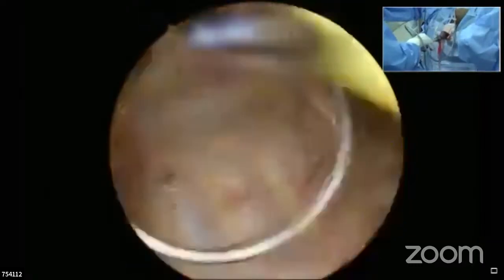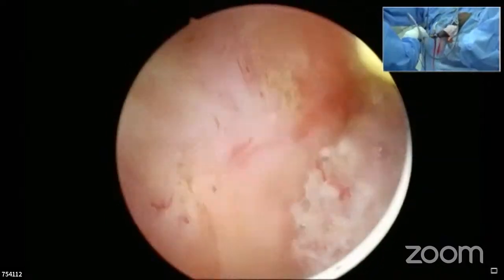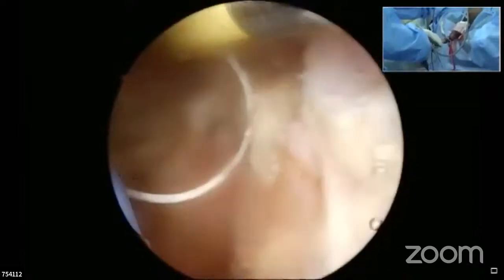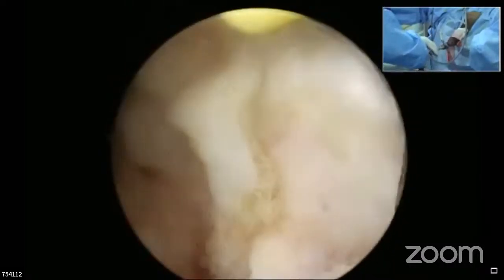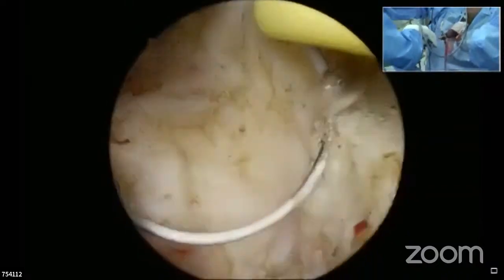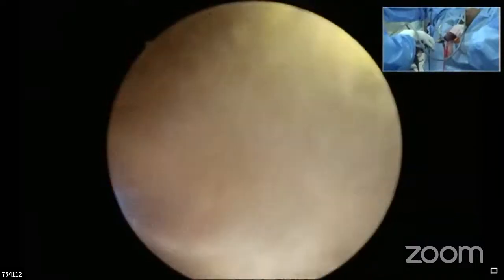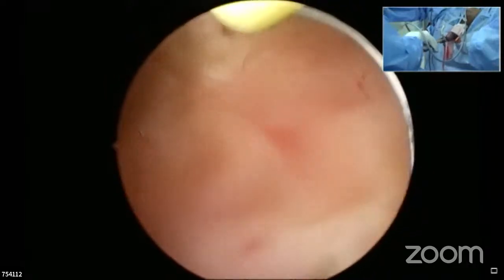So, do you think that's an indication for using 22 French? Because we commonly use 22 French for, say, 45 to 50 gram prostates. I don't have it actually. I have no choice. No, the loop size is small, so you take longer using a smaller scope. Yeah, agreed, but you can make it work for glands up to 45 to 50 grams with 22 French because it is very comfortable. The movement excursion within the urethra is so smooth. Actually, I don't have it in my department, so I will now recommend they buy a 22 French resectoscope sheath.